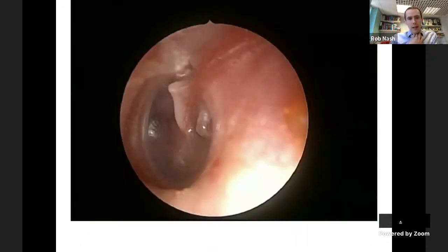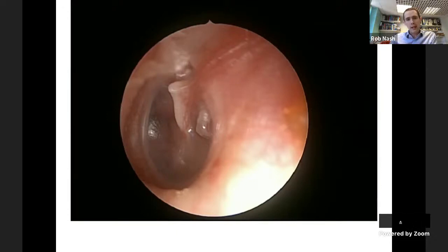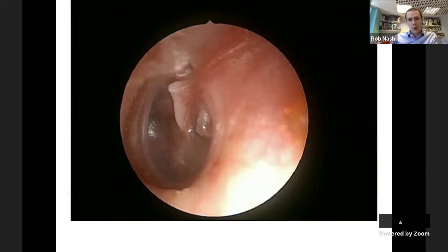This case is potentially different. There's probably middle ear fluid based on the color of the eardrum and the retraction is more pronounced, but more importantly the morphology of the ear canal limits our view of the posterior aspect of the retraction. It's possible there's a focal pocket developing into cholesteatoma in the pars flaccida or just posterior to the incus. A case like this would be much more likely to prompt a CT request looking for cholesteatoma.